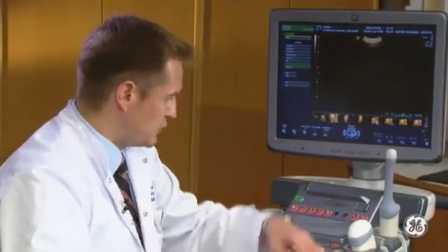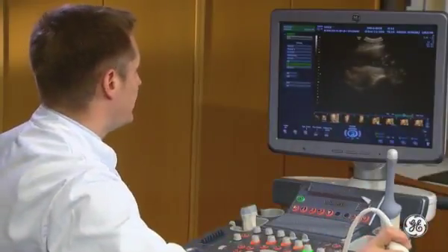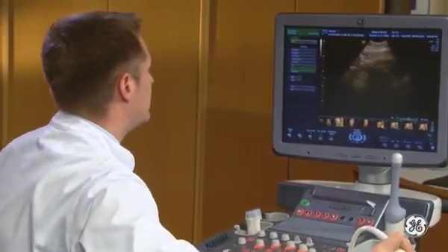There are default presets that use some of these functions, but they are intended for an average patient who in fact does not exist. This is why operators should learn the basics of image optimization. Let's try to improve my imaging of the fetal trunk, and we'll start from the fundamental settings, step by step.